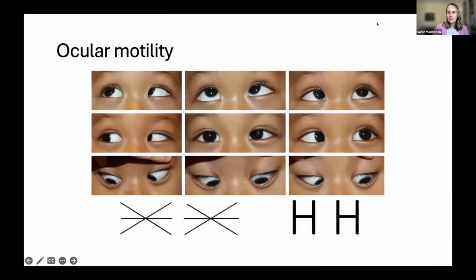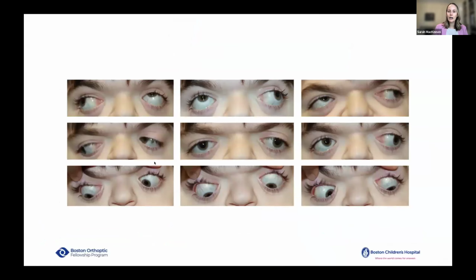Whether you use muscle stars or H's or another grading system, determining how well someone's eyes move can be easy in cooperative patients with full or essentially full eye movements. It's often the quickest part of the sensory motor exam. Even in complex ocular motility patterns, a cooperative patient can make the ocular motility exam relatively easy, allowing you to look, and then look again, and then again if needed. This is not a luxury we have with most of our young patients, where sometimes a fleeting glance is all that they're going to give you.